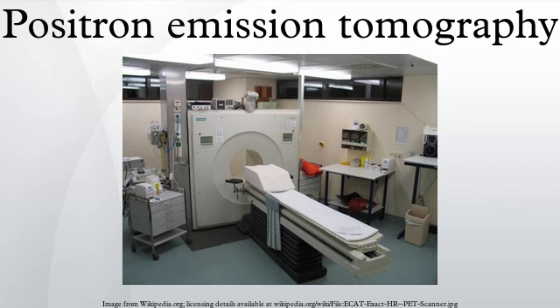A new chemical process may increase the utility of positron-emission tomography in creating real-time 3D images of chemical activity occurring inside the body. This new work holds out the tantalizing possibility of using PET scans to peer into a number of functions inside animals and humans by simplifying the process of using tracer molecules to create the 3D images. Small animal imaging: PET technology for small animal imaging.